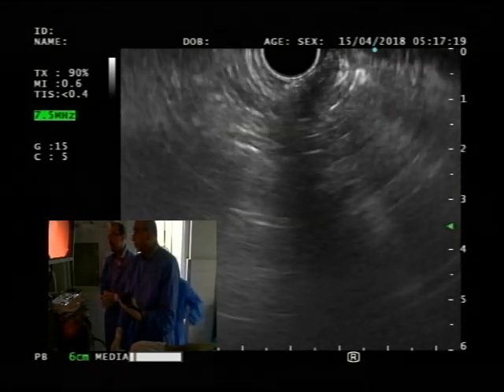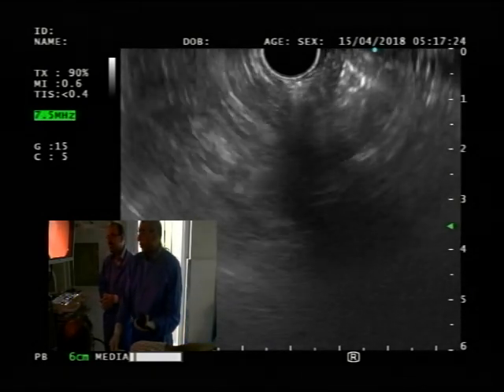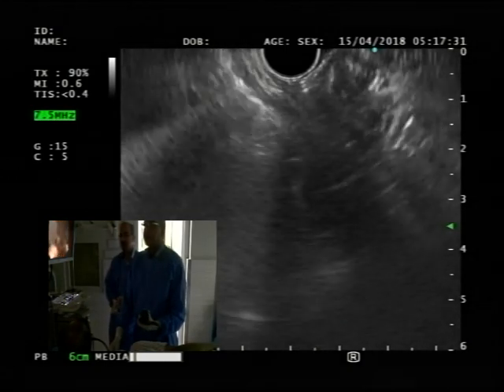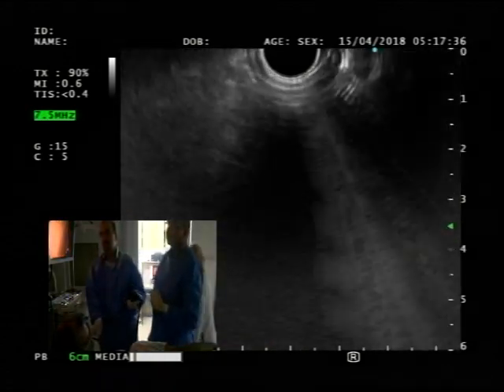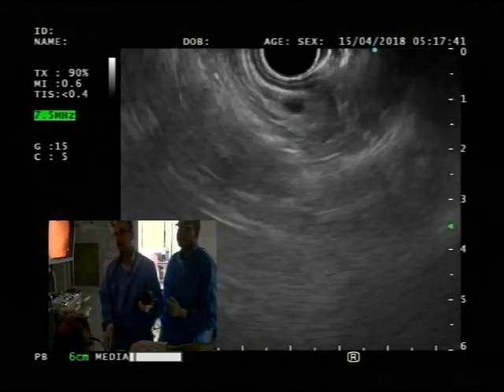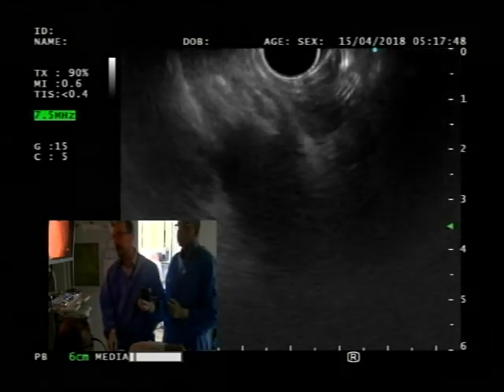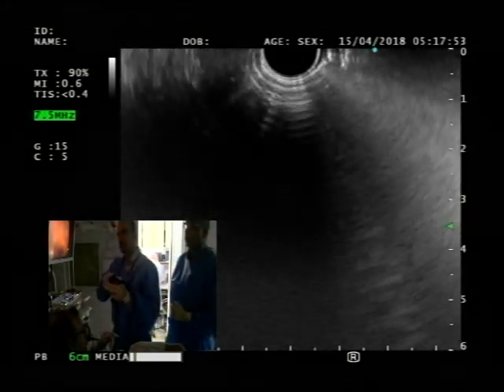I can't take it away from Shaukat Khanam Hospital and Asim Yusuf, who were a great help. They were the ones who were doing this, and I got their tech for a week into our unit, and then he came and trained our techs, and then we started looking at it and gave us feedback, and it worked. Yes, that's excellent. I think Khalid's unit in Florida also does a very nice workshop. It's a 2.5 hour workshop that they do for this particular thing, and that was also very useful. Yeah. I think once you're doing it, if you go back and see them, that was also very useful.